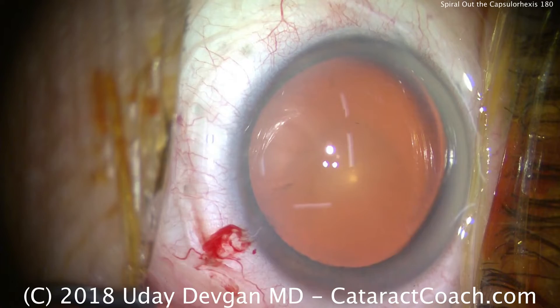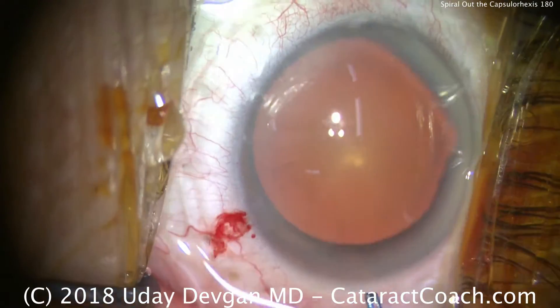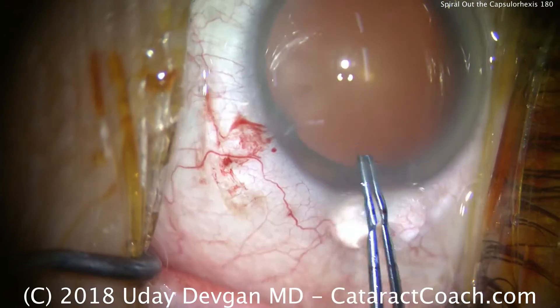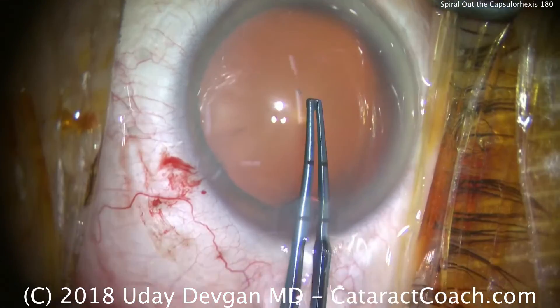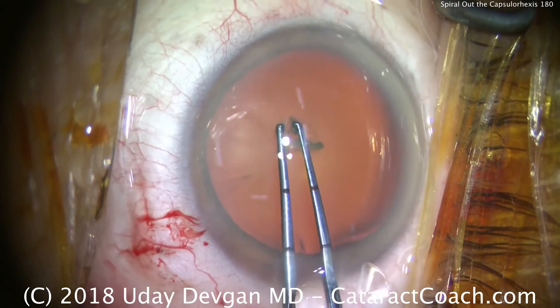Here's our eye, already full of viscoelastic. We've made the main incision, and we're going to get our capsulorrhexis forceps here. So we've got our capsulorrhexis forceps going in the eye. That's about the size we want — poke in the center, and we'll start off on the smaller side.